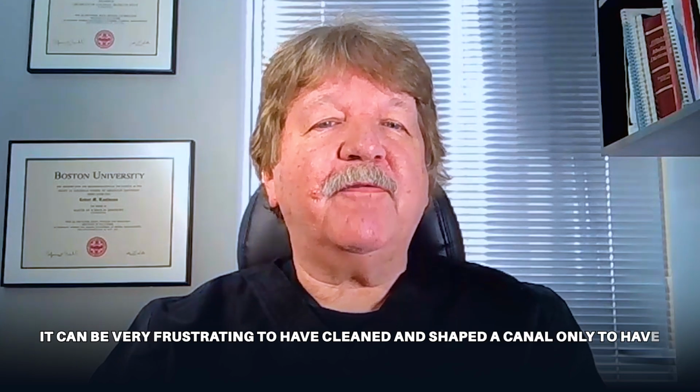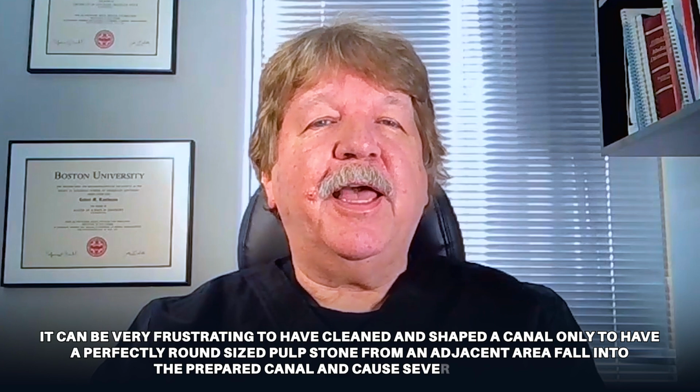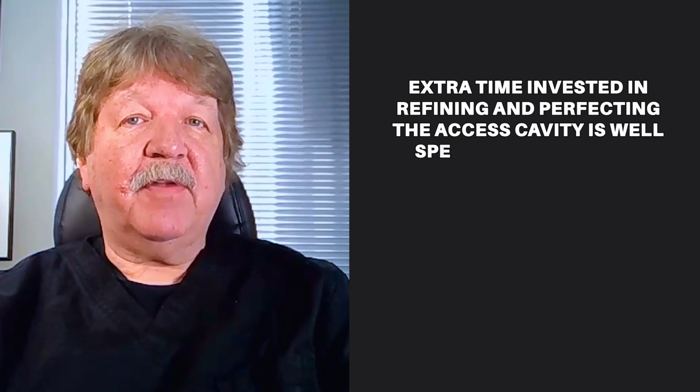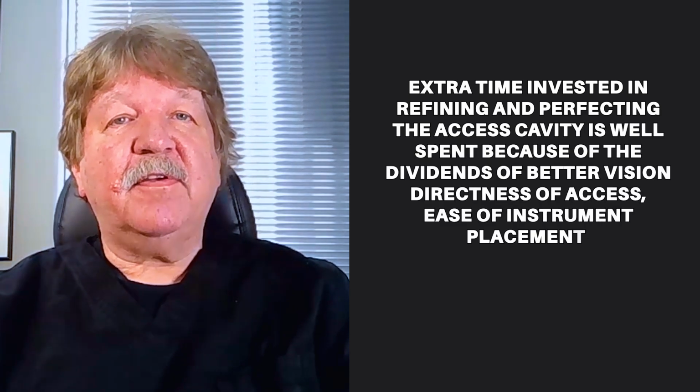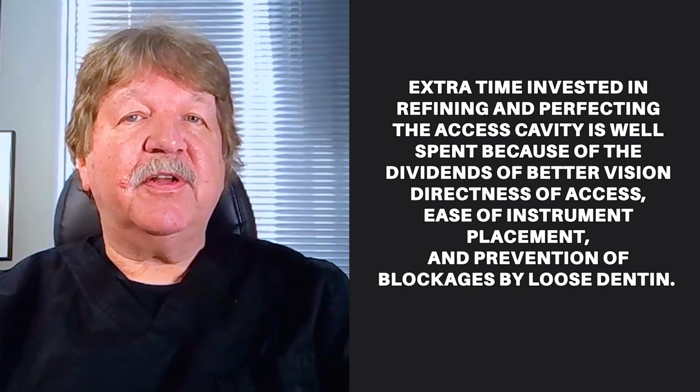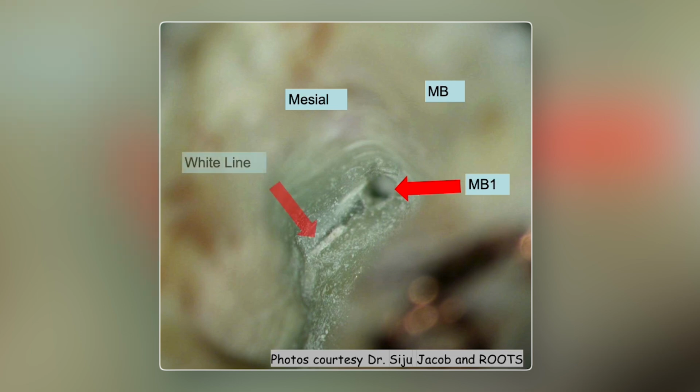It can be very frustrating to have cleaned and shaped a canal only to have a perfectly round-sized pulp stone from an adjacent area fall into the prepared canal and cause severe blockage. That's why taking time to work on the access cavity is so important. As my friend Dr. Terry Pankak says, extra time invested in refining and perfecting the access cavity is well spent because of the dividends of better vision, directness of access, ease of instrument placement, and prevention of blockages by loose dentin.